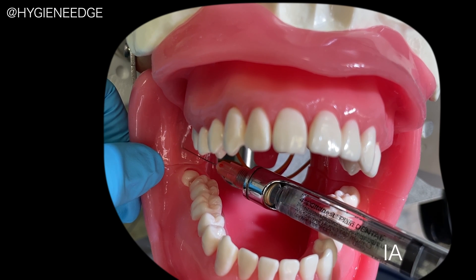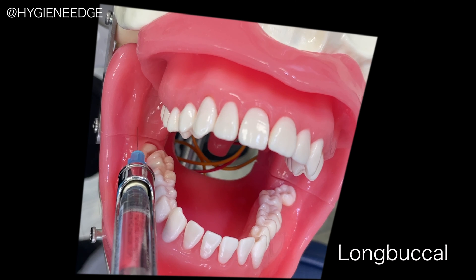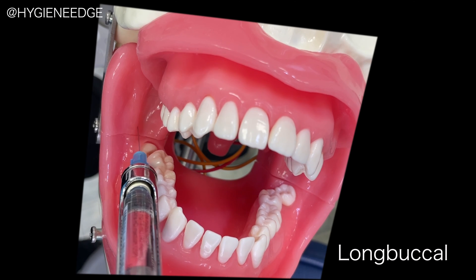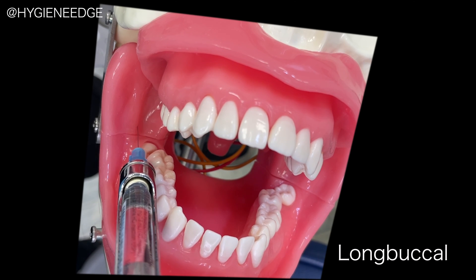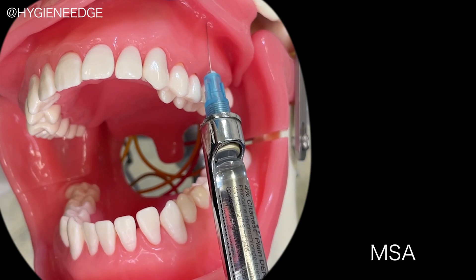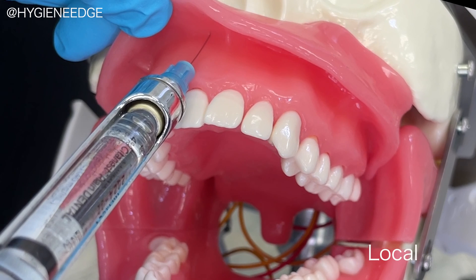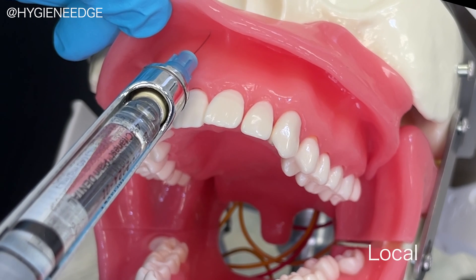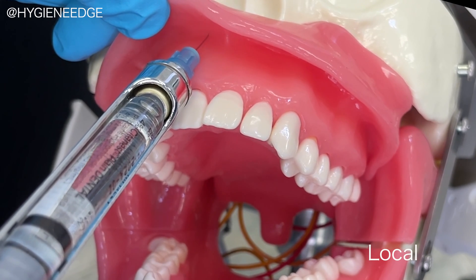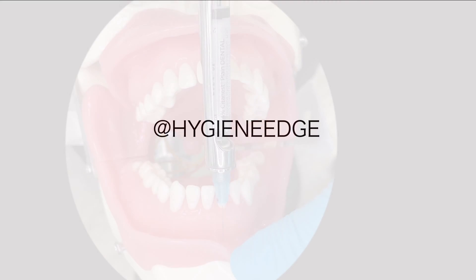Even if the area doesn't have a sensor, you can still practice all of the injections, such as the long buccal with the needle parallel to the occlusal plane, the MSAs over that second premolar, and the locals deposited at the apex of the tooth.